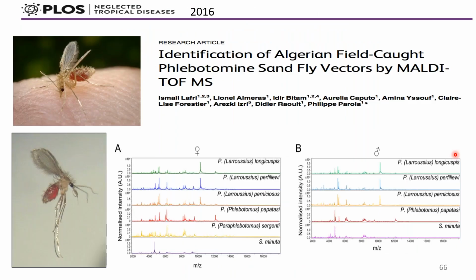We also tried with sandflies. And so again, we went for the legs and it didn't work. It was really important to find a tool for the identification of sandflies. If you've never seen a sandfly, it's extremely small. And the morphological identification is based on the genitalia, so the reproductive system of the sandfly, which is of course internal. So you have to mount the sample. And it's just a pain. And it was really nice to have something that would, again, make things so much easier.